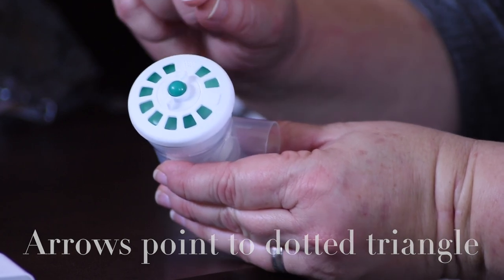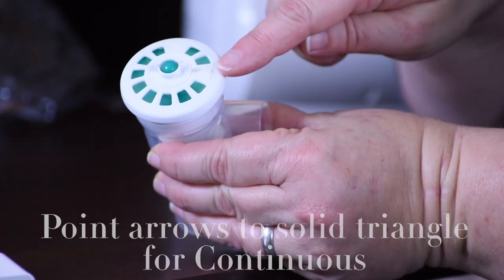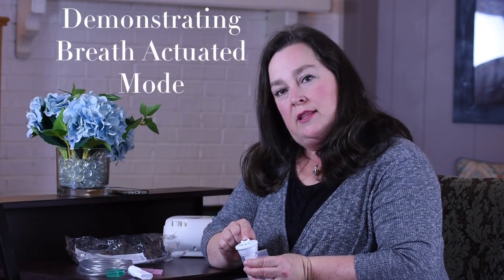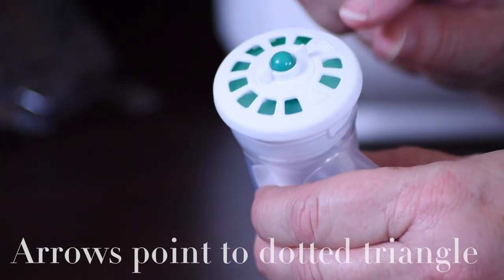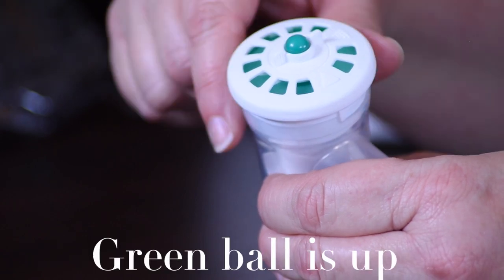To change it to continuous flow, we would point the arrows toward the solid triangle and then notice that the ball is in the down position. For this demonstration, we're going to demonstrate the breath actuated mode, so we're going to turn the arrows back toward the dotted triangle and make sure that the ball is in the up position.